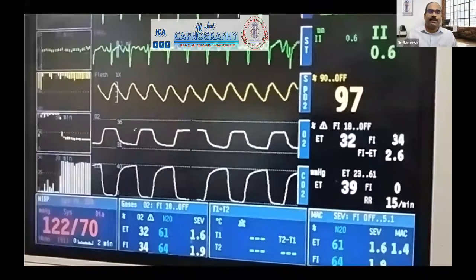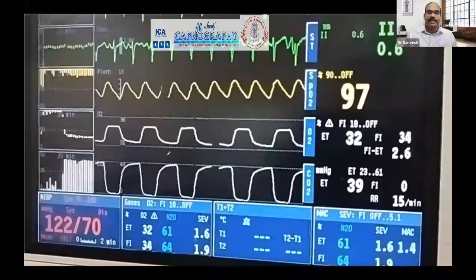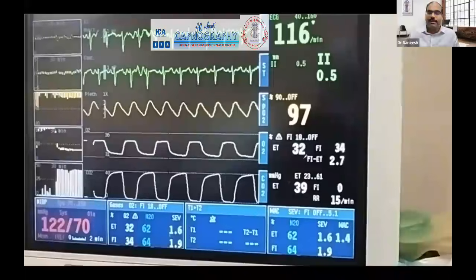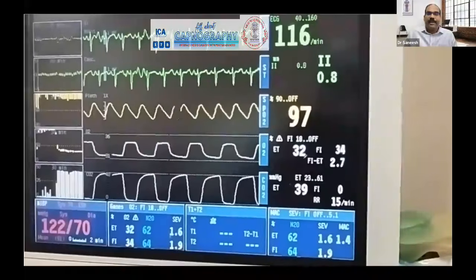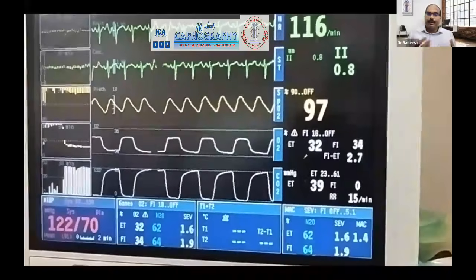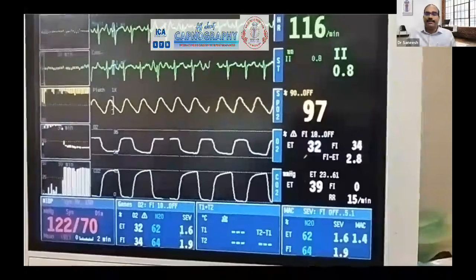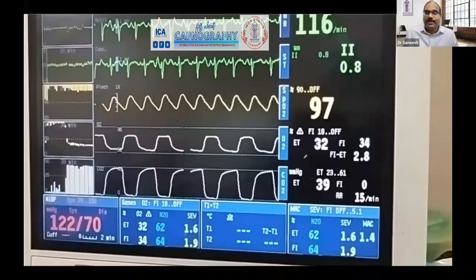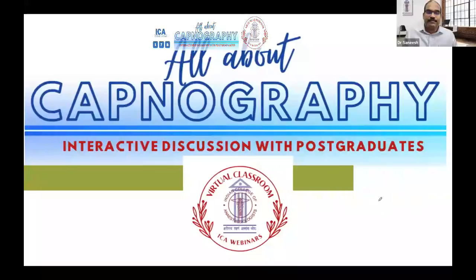Because during inspiration, oxygen level increases, and during exhalation the level decreases. Usually the difference between inspired and exhaled concentration will be less than 5. And some others believe that when the patient becomes lighter in plane, oxygen extraction increases and the difference between inspired and exhaled concentration also increases. So I think there is scope for continued interest in oxygraphy also, but I am not sure how much the literature supports its utility in perioperative settings.